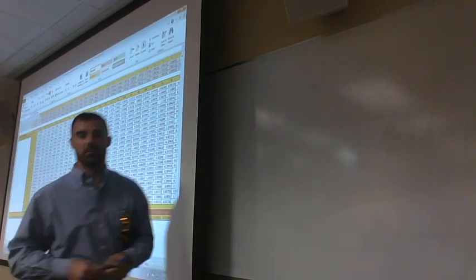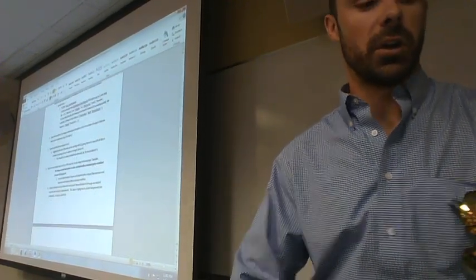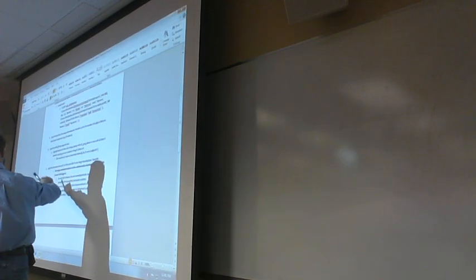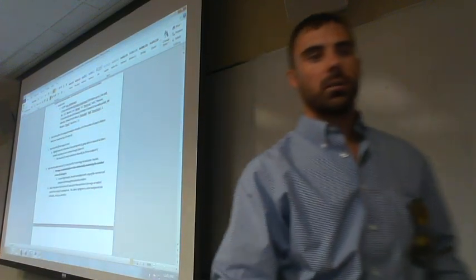So this is our range normalized thing for all of our subjects, for all of their electrode sites, for this effect. So then what you'll do next, and this is shown here on our instruction sheet, okay, so we've already done open the range normalization, open the text of the stat output, highlight select, yes, we got those. Paste that information in the C12, we just did that, okay? Now, it shows how the data table on the bottom left, as part of the worksheet, is the range normalized of each score. We just talked about that. It's highlighted in yellow. We just saw that. Okay?